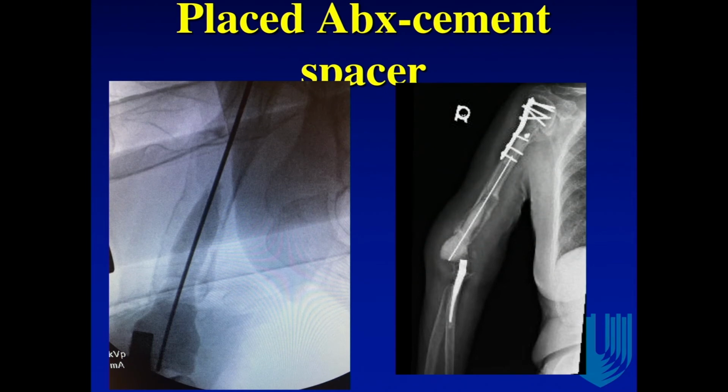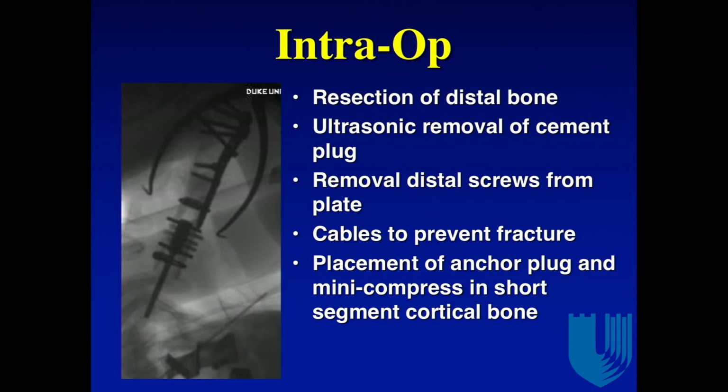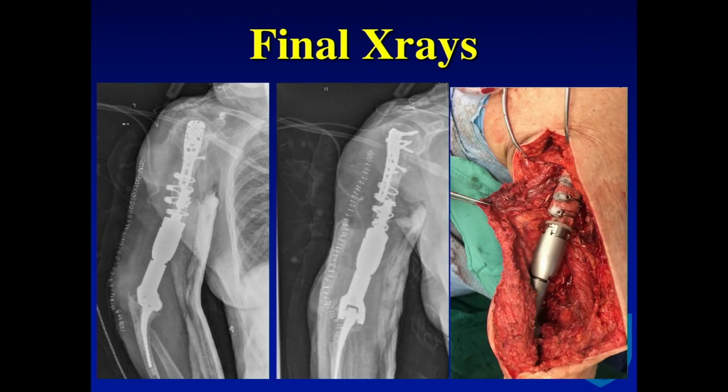So now you get the cement out, put in a cement spacer, and here she is. There are a variety of cement spacer constructs that are available. I've used them all. Right now I'm using a linked Steinmann pin that is linked together with a Steinmann pin in the ulna and a cement plug around them. Now you can see these custom implants that Zimmer has devised. It's a way to get some bone distally, to get some stress on the distal portion of the humerus and build up the bone so that you have something to work with. You can see the use of this device in the revision case. And so the endoprosthetic tumor device can then be placed with your struts, as you see here, and that's what that's going to look like.